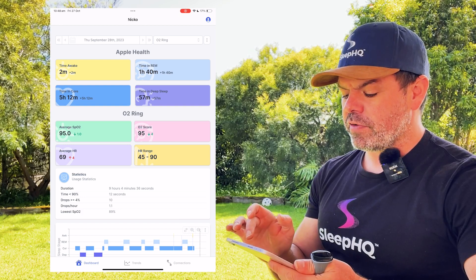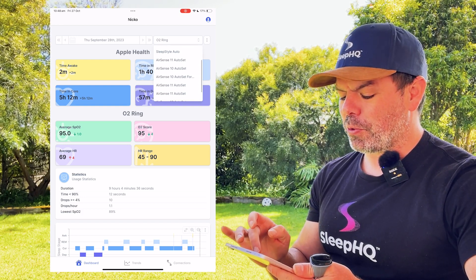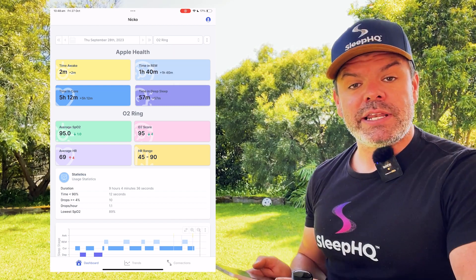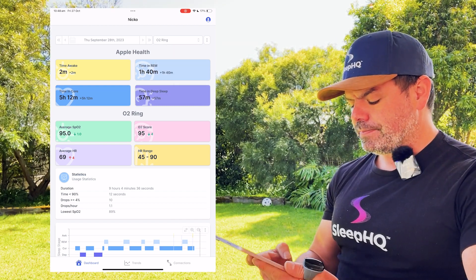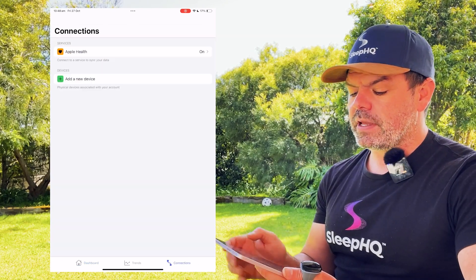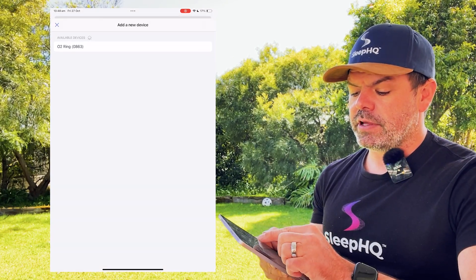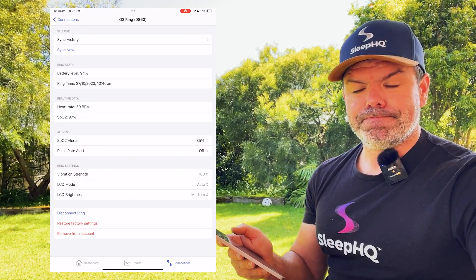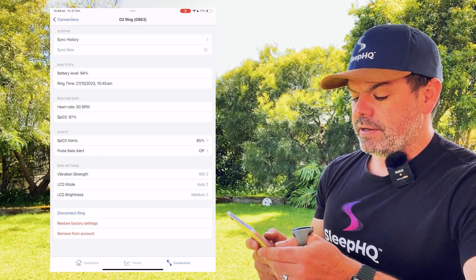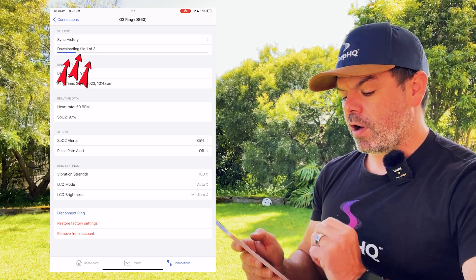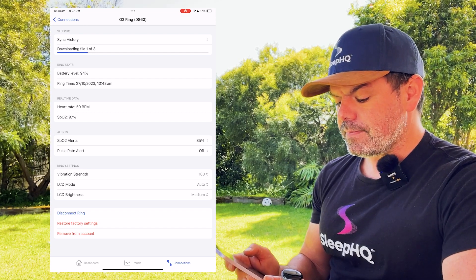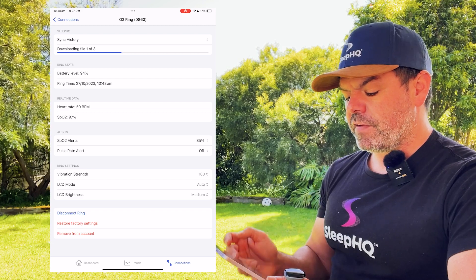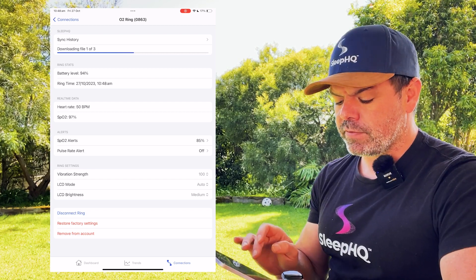This here is my O2 ring dashboard, and you can easily switch devices just up here. I've got quite a few devices, as you can imagine — always testing out different gear. I'll show you how easy it is to connect up an O2 ring. Just go to Connections at the bottom, Add New Device — there it is right there, O2 ring, and it's connected. You can see it's already downloading the files — downloading file one of three. Battery level 94%, and I've also got real-time data: heart rate at 50 beats per minute and blood oxygen level 97%.